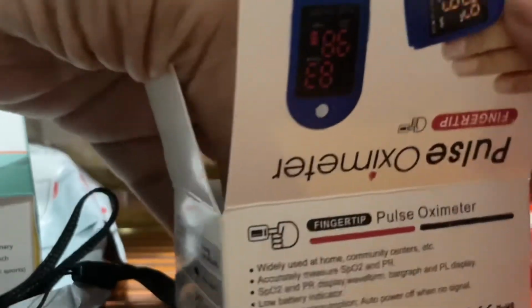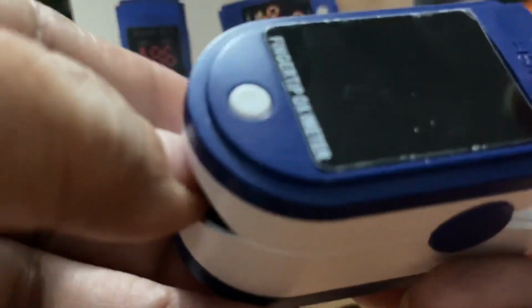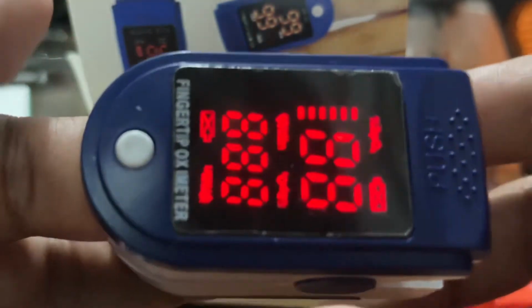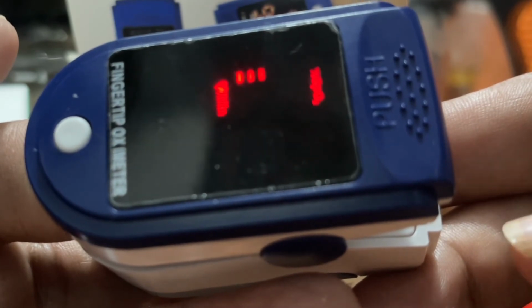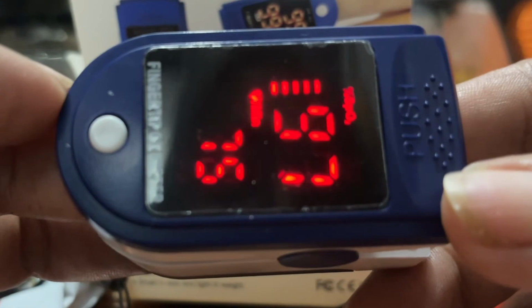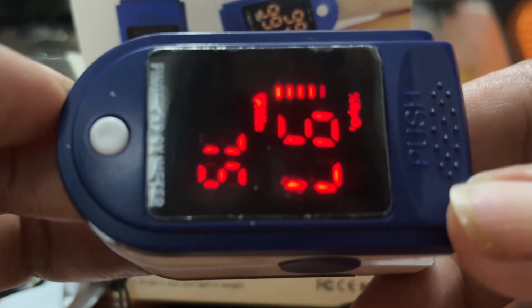The pulse oximeter is a clip-like device that is attached to a body part, such as a finger or earlobe. This device uses light to measure how much oxygen is in the blood. This information helps to know if a person needs extra oxygen. It can show whether the heart and lungs are supplying sufficient oxygen through your body. Okay, what else do we need to know?